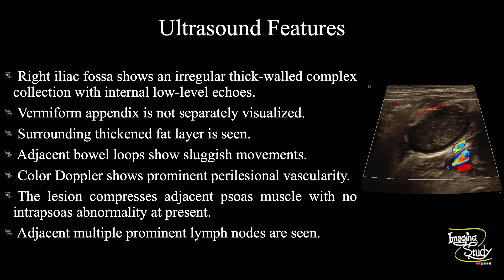In summary, the right iliac fossa shows an irregular thick-walled complex collection with internal low-level echoes. The vermiform appendix is not separately visualized. Surrounding fat plane thickening is seen. The adjacent bowel loops show sluggish movements. Color Doppler shows prominent perilesional vascularity. The lesion compresses the adjacent psoas muscle with no intra-psoas abnormality at present. Multiple prominent adjacent lymph nodes are seen. These features conclude as a case of right iliac fossa abscess, possibly of appendicular origin.